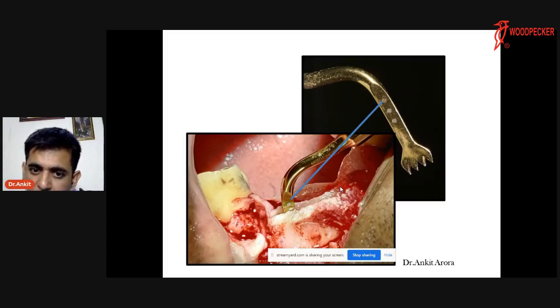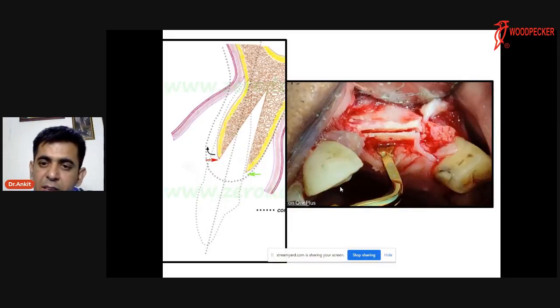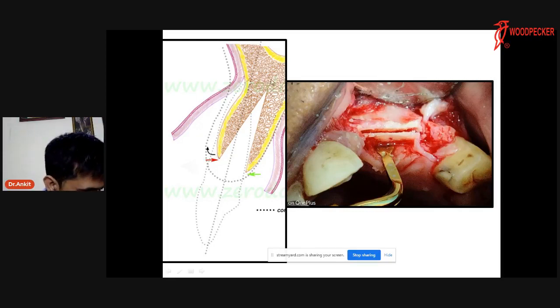And in the coming slides, you can still see proper blood circulation in the split crest. In the diagram on the left, you can see the split, and accordingly we can see in this clinical picture where we have gone into the crest in the undivided bone, right? In that undivided bone, which is now being seen with this arrow, we need to engage our implants. So in such a scenario, we need to properly engage it, right?